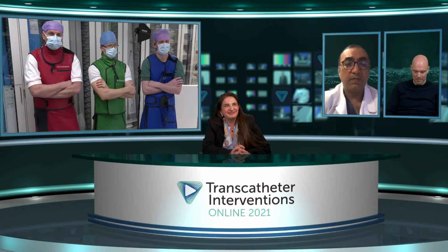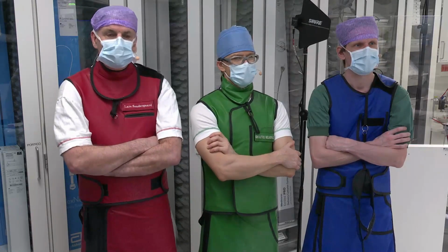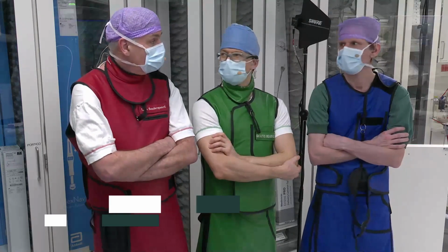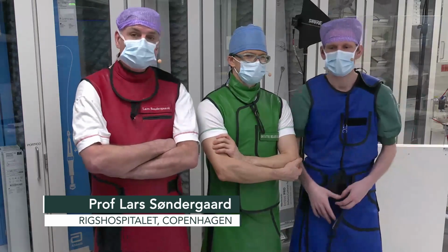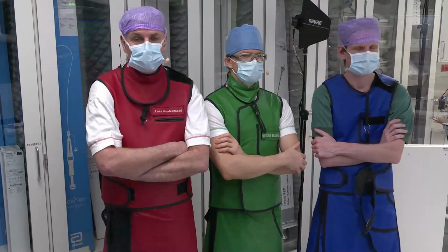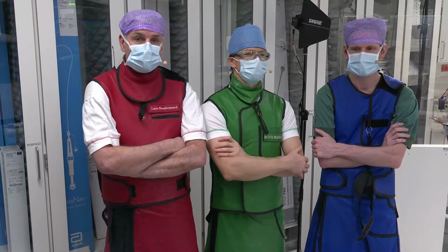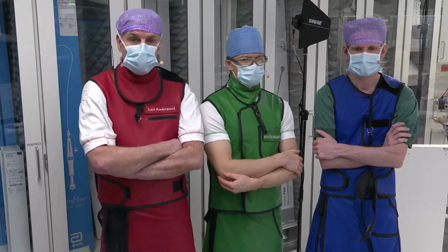I think we need to see more evidence on this therapy. I mean, the evidence we have so far is what's supposed to call it the PROTECT AF and PREVAIL trials, but that was against vitamin K antagonist, which no one is using anymore. There are 2 large-scale trials ongoing. Abbott has conducted the Catalyst trial, and Boston Scientific the Champion trial.